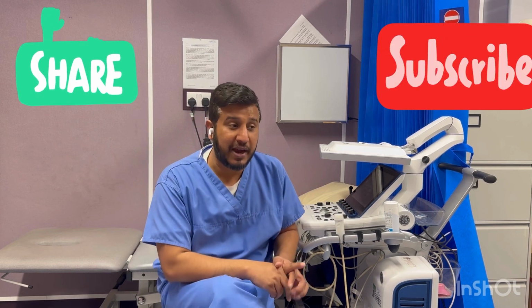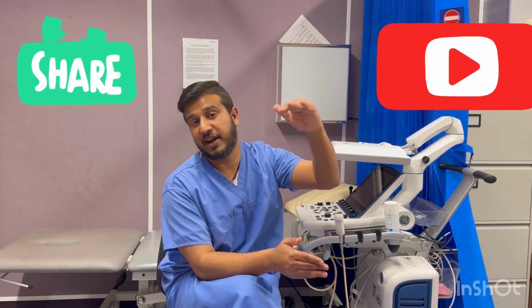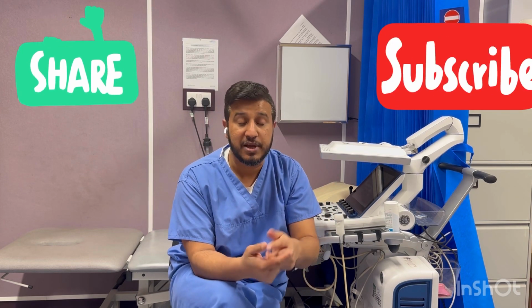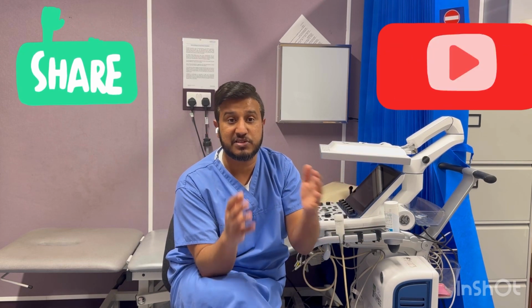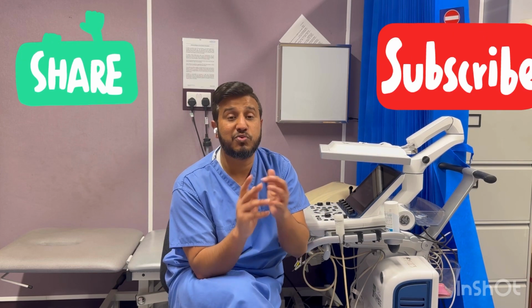Always keep in your mind, once you are getting the parasternal images, try to get them as high as you can. And once you are getting the apical views, try to go as far down as you can, so you will see the true apex. For both views, parasternal imaging and apical imaging, you might get it in different places. You might get 3-4 different images, but you need to understand which one is the best image and which information you are going to get.